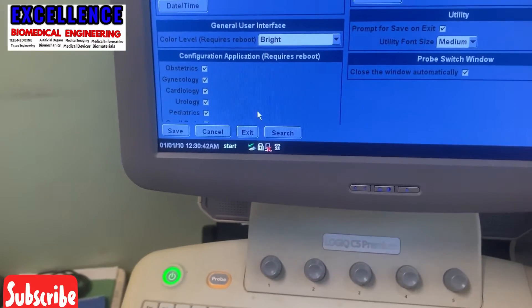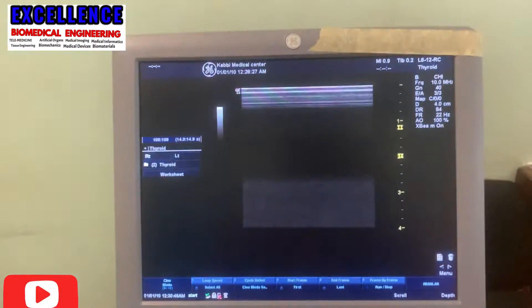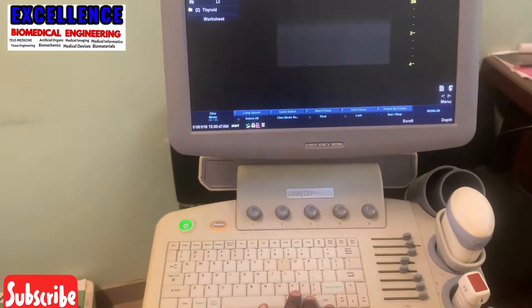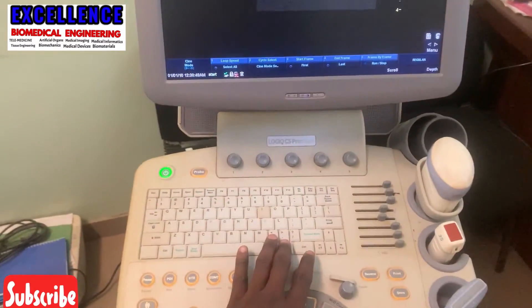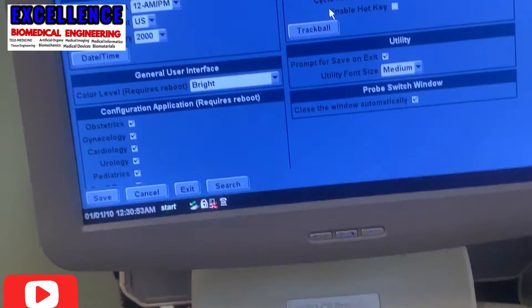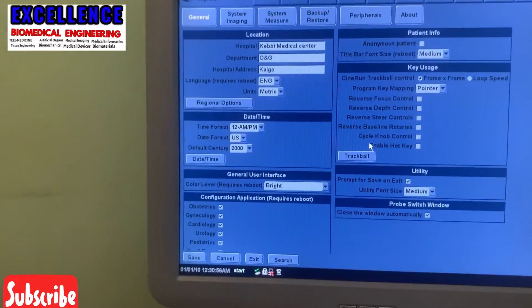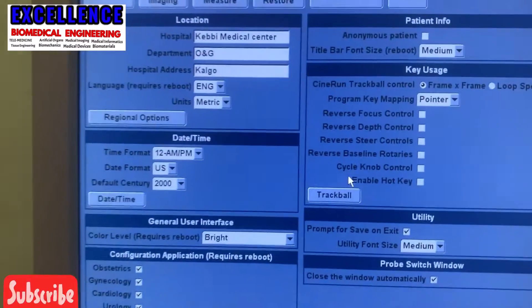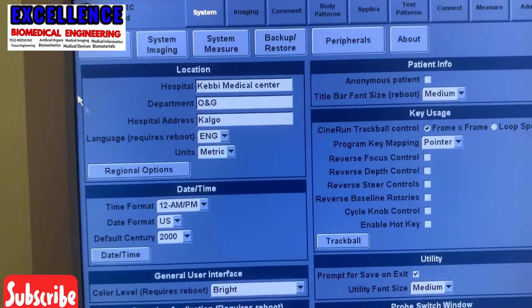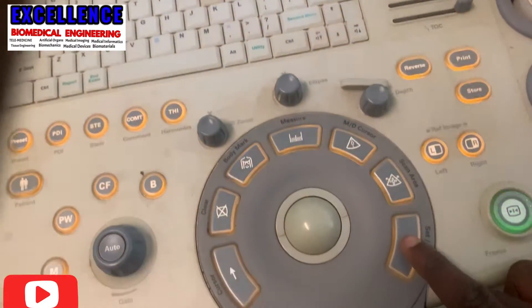Then you use your knob to navigate throughout the settings area, and thereby you get to change your time and date. I click the utility button and use the knob to scroll down to date and time, then I click on date and time.